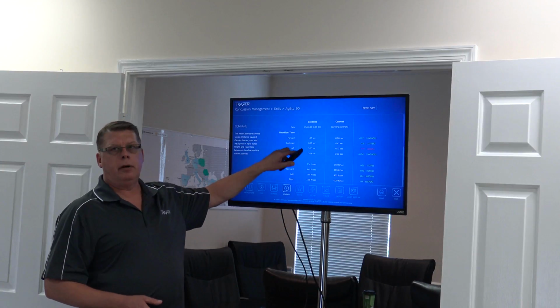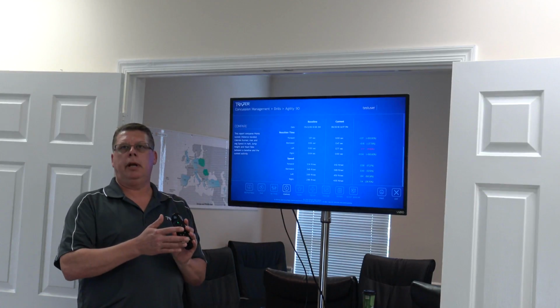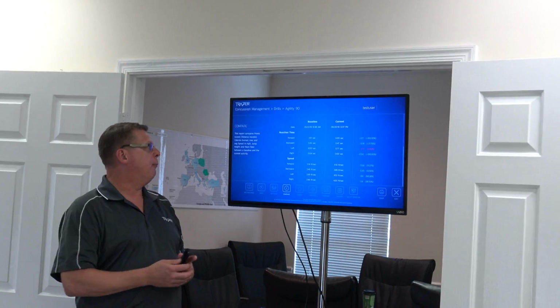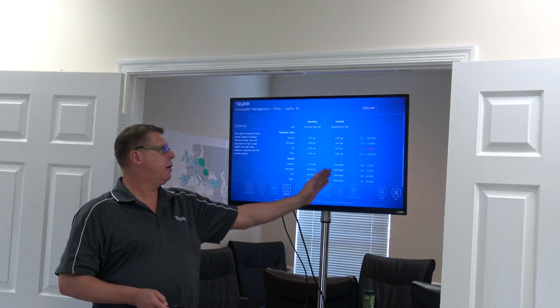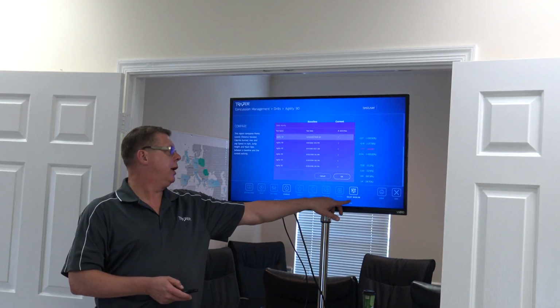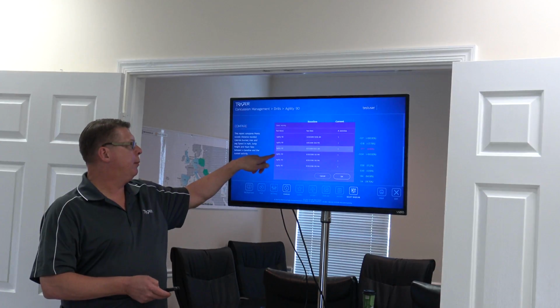With regard to reports, going into the Agility 90 as an example, you can compare the baseline, so it always defaults to the earliest activity for that. Every time you do an activity, a date time stamps that activity so you can track it longitudinally over time. So if this was the baseline and this was preseason and this is the current activity, I can simply go to select baseline, click on that, and then go in and pick a different point in time for comparison.